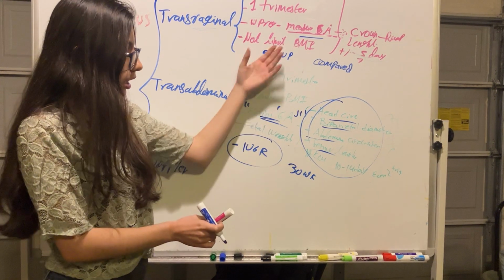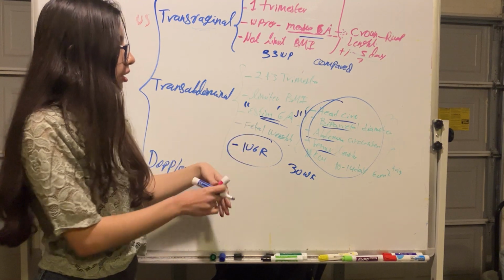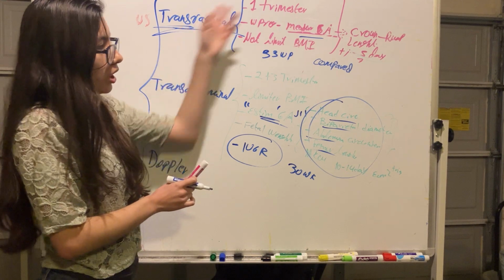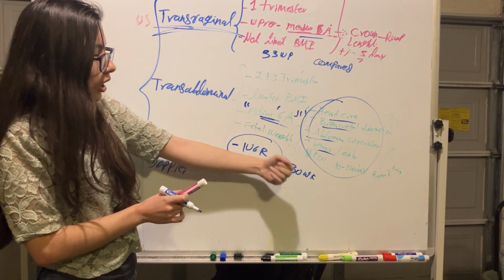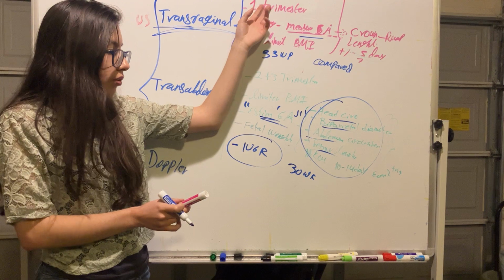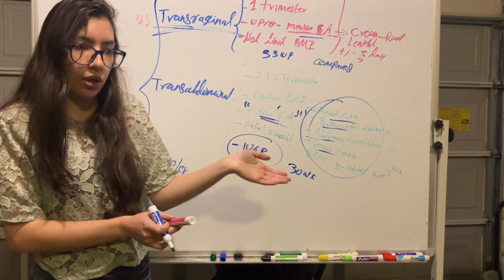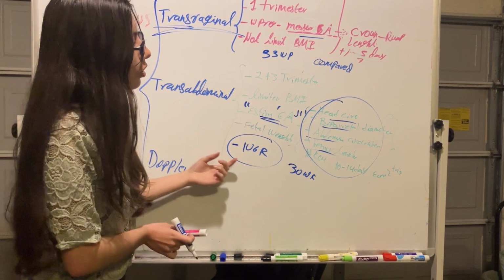So for this, it is important to compare gestational weeks based on the first one established during the transvaginal ultrasound in the first trimester and the transabdominal ultrasound during the second trimester, even though the one we use to estimate gestational age is the transvaginal ultrasound. We need to compare with each transabdominal ultrasound during the second and third trimester to evaluate for intrauterine growth restriction.